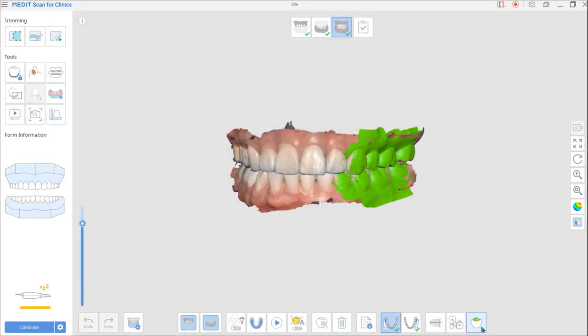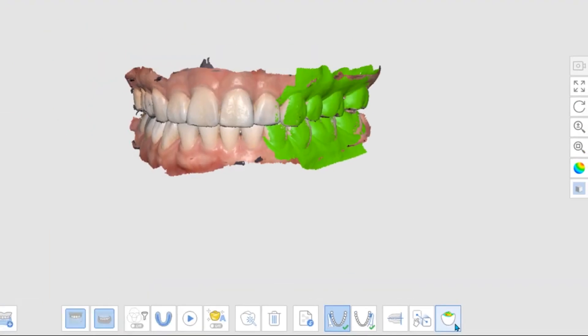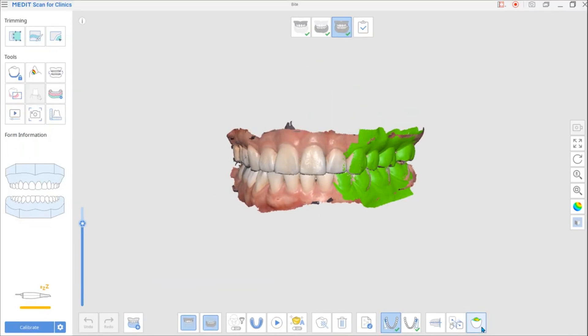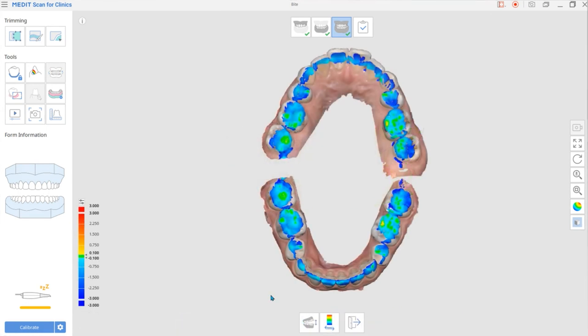In the occlusion scan stage, click the Occlusion Analysis button. The system analyzes occlusal contacts and shows them as colors. You can compare it with the actual occlusal marking paper from a patient before the scan. As you can see, the software analyzes and displays the occlusal contacts as colors.